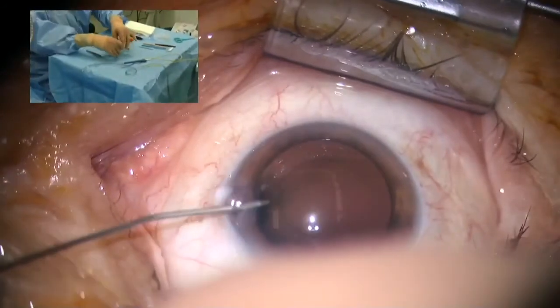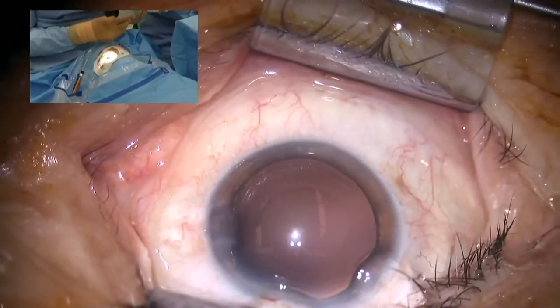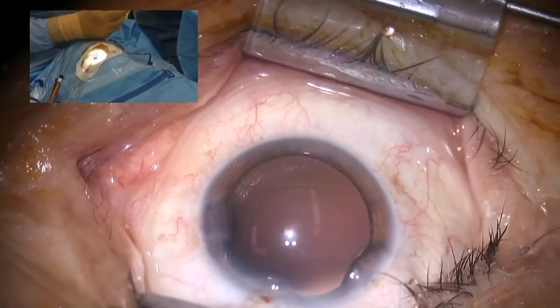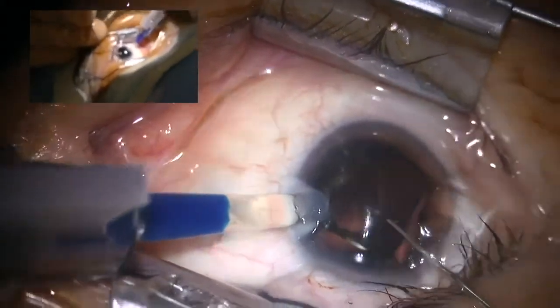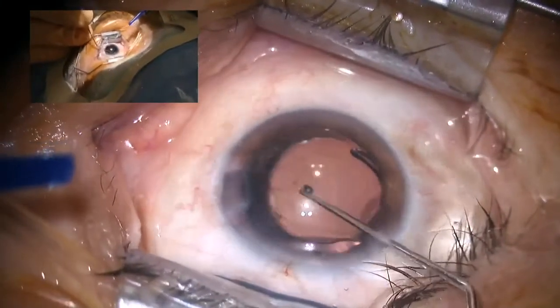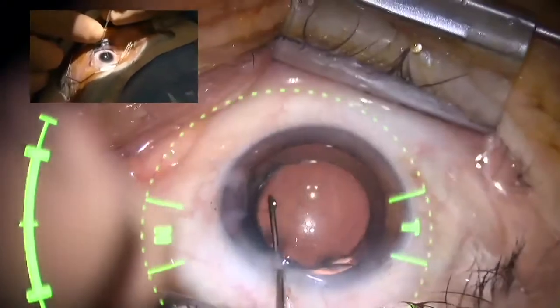So now we will do the implantation of the toric IOL. It's a hydrophobic IOL, a normal 3-piece design. This one is not preloaded because it's 26 diopters with a torus of 2 diopters. It's very easy to implant it. The implantation axis is 94 degrees.